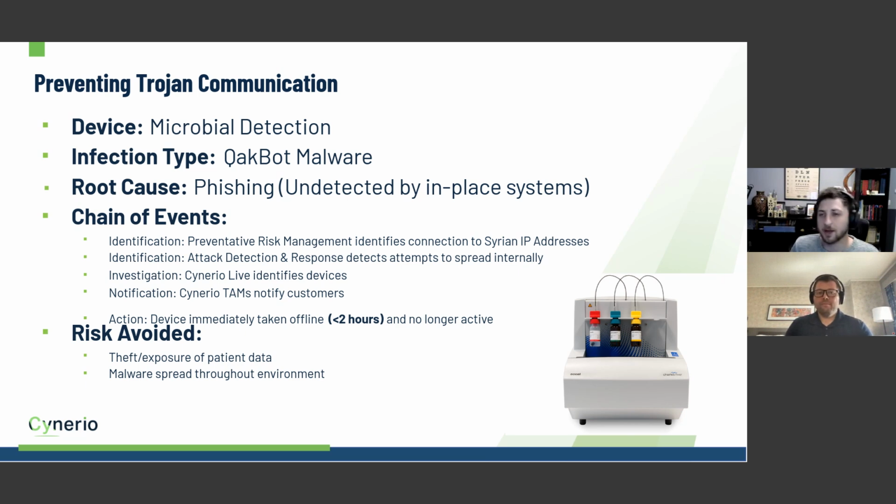They're being controlled by some sort of laboratory management system or laboratory information system or something like that. And so they're constantly talking to their server. They're constantly saying, hey, I'm available for a test. I'm still running that test. I'm 90% through. I'm 91% through, and so on and so forth.